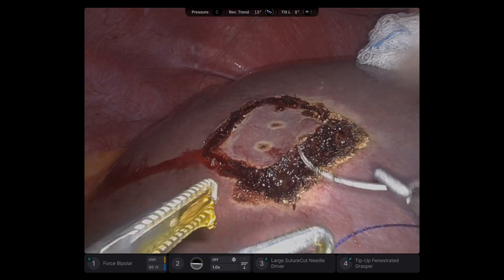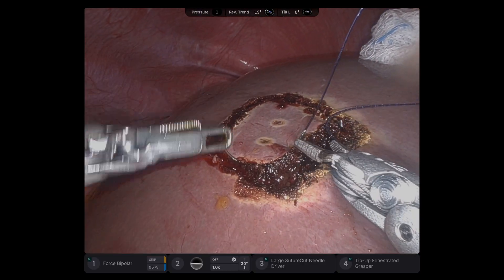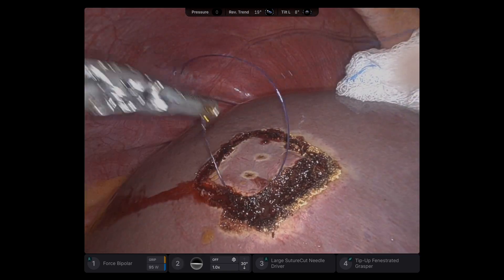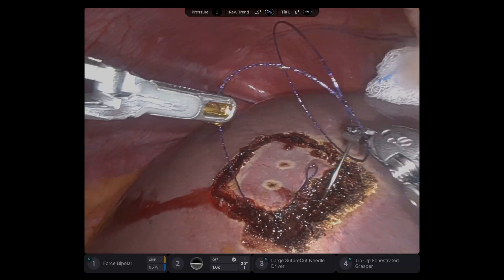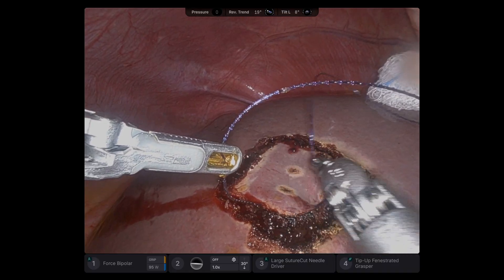I do a diamond-shaped technique. Here I want to show a technique I learned from watching a video from Professor Eduardo Rosso. It's a very neat technique — basically lifting the specimen up without needing a separate instrument, and freeing both your hands.